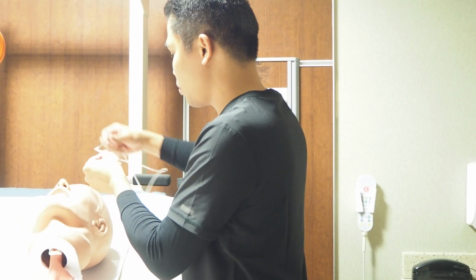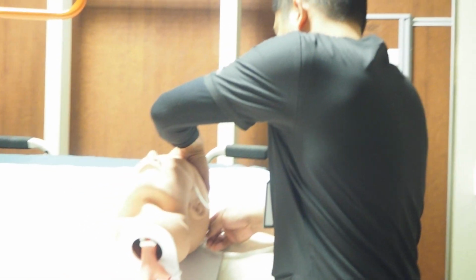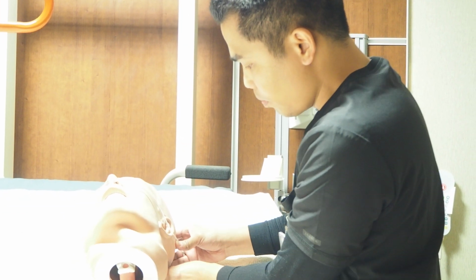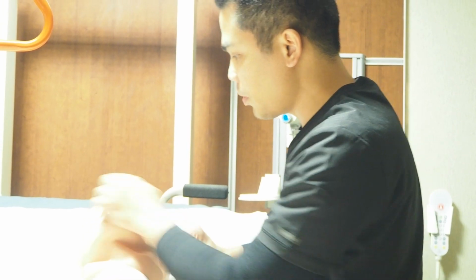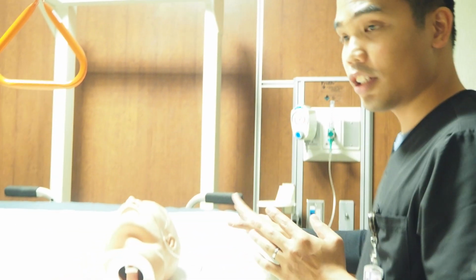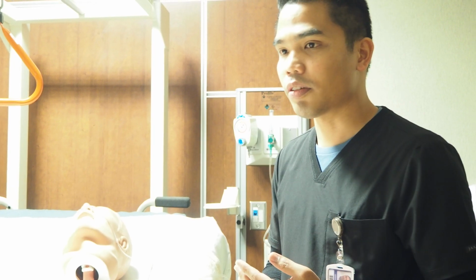So I'll just put this gently to your nose, and then I'll have to lift your head a little bit so that I can put this on your head carefully. So I'll just loosen up the connections a bit, and then I'm going to assess the patient afterwards. So like this, the patient is already on the nasal cannula. I'm going to reassess the patient, and then after that I'm going to leave, and in a few minutes I will reassess the patient.